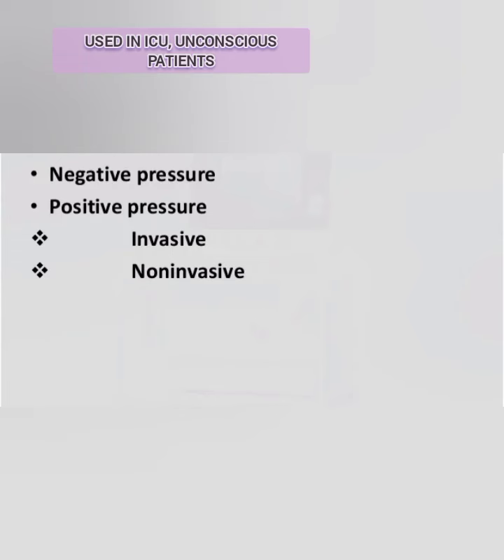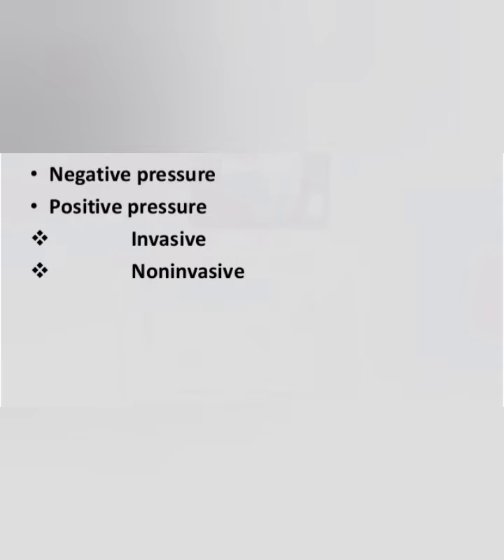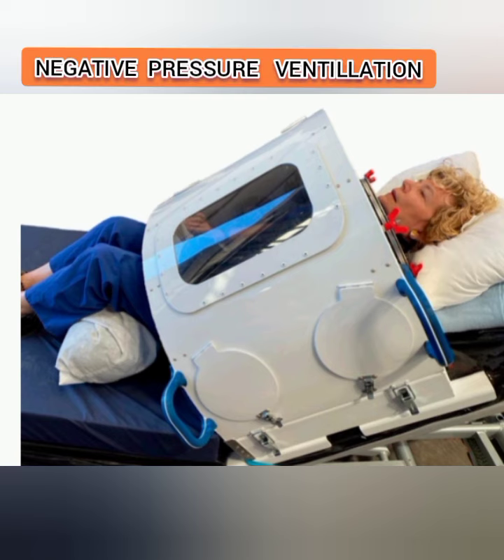Now, I would like to talk about the different types of mechanical ventilation: negative pressure ventilation and positive pressure ventilation. Under positive pressure ventilation, there are two types, invasive and non-invasive mechanical ventilation. First, I would like to talk about negative pressure ventilation.